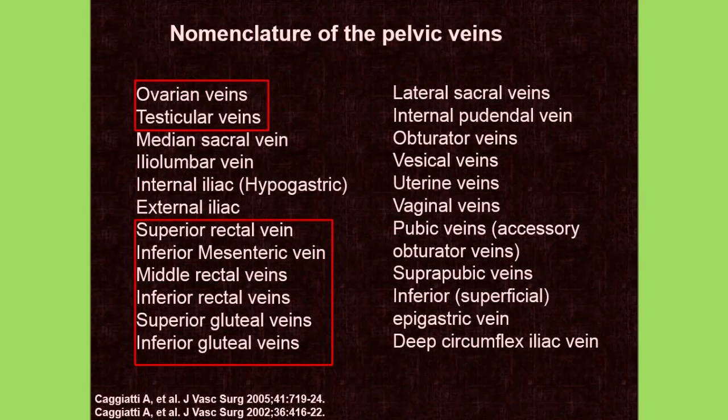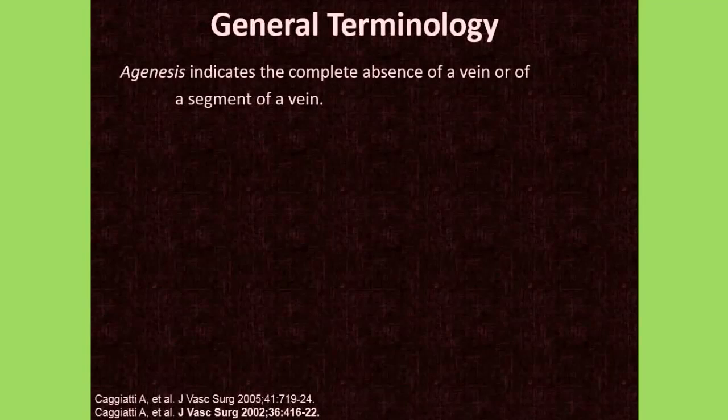And then the other pelvic veins you can see on the right-hand side. That inferior superficial epigastric vein, that's important because it's the entrance of that vein into the saphenous vein up near the saphenofemoral junction. That is important when we're contemplating doing an ablation procedure on the great saphenous vein. And so we have to preserve flow through that vein in order to have a successful procedure without thrombus extension into the common femoral vein.